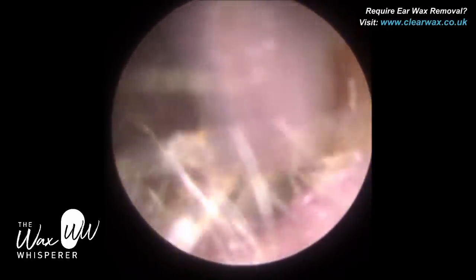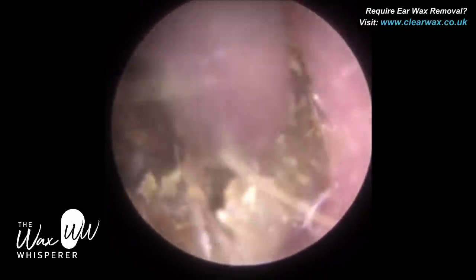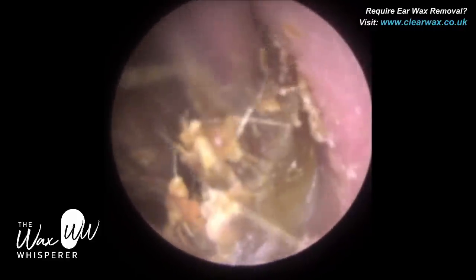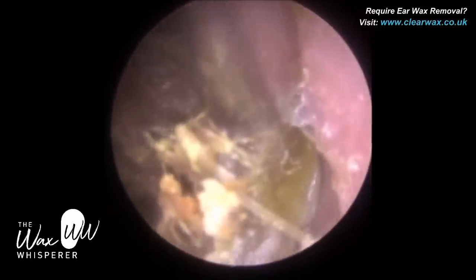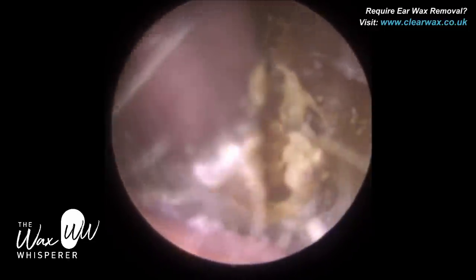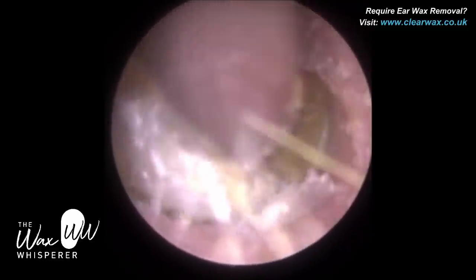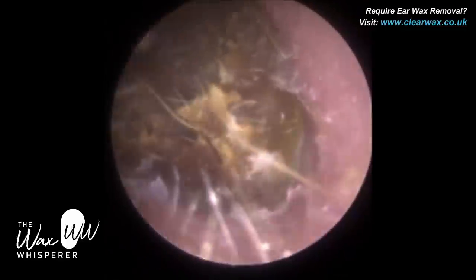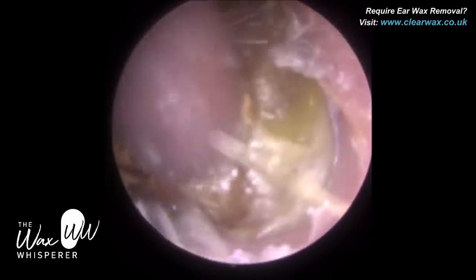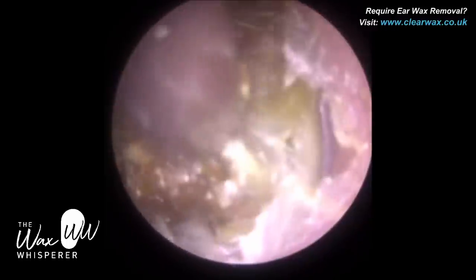So now I've just gone back in with the suction probe, probably about a centimetre into the ear at the moment. You can see this wax is coated with some dead skin — a glossy light brown colour all the way around the edge. The skin posteriorly, so to the back part of the ear, is a lot thicker than the opposite side. I can see the skin has got a bit damp and soggy — it's a horrible consistency to remove. If we could put some drops in the ear at this stage, it would have been very useful. You can see all that keratin there.